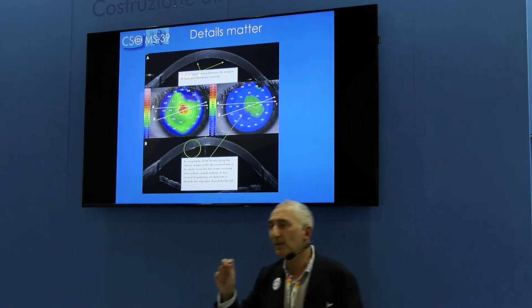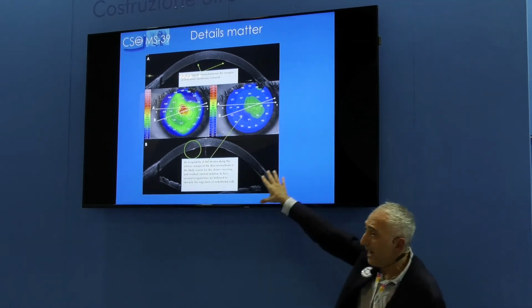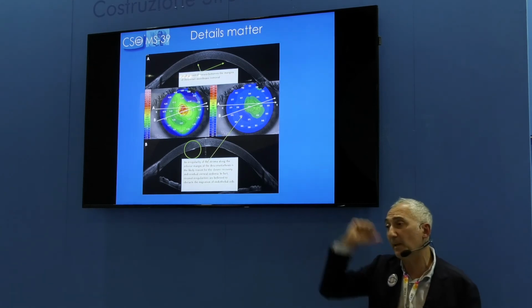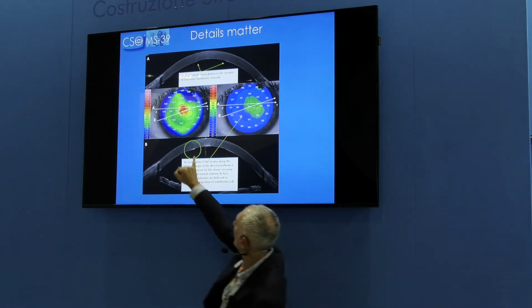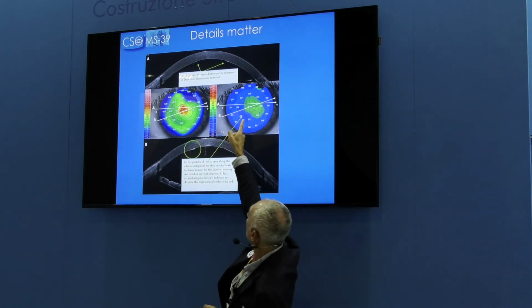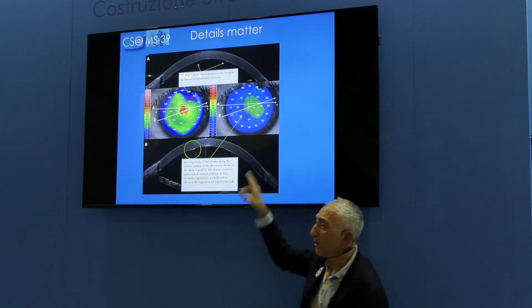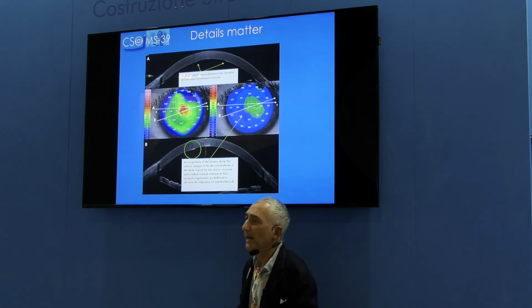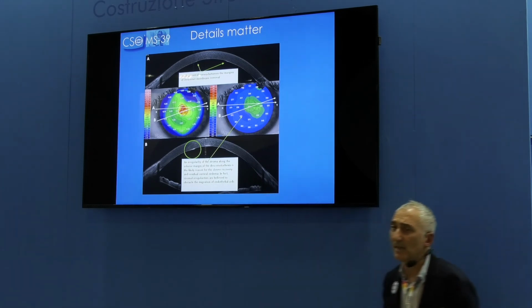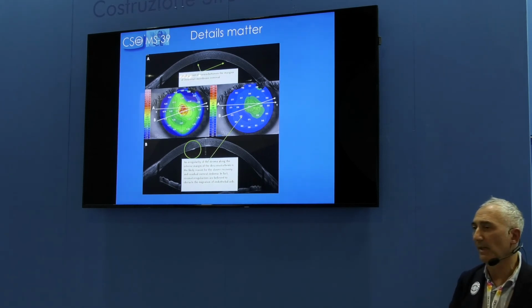Yes, a little bit, because now the central cornea is thinner than in the beginning. And this is the very last thing. This point corresponds to the area where the recovery was slow, most likely because endothelial cells cannot migrate over this irregularity. So it's beautiful with this instrument. We can see things, measure them, understand a lot.